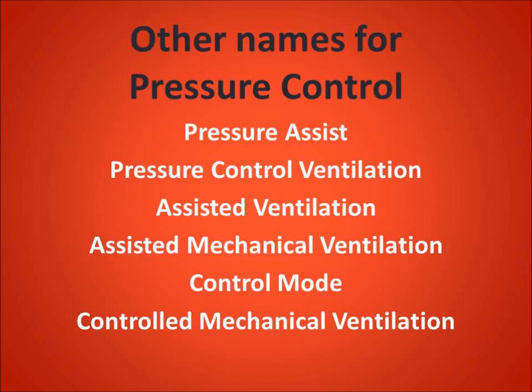Other names for pressure control are pressure assist control, pressure control ventilation, assisted ventilation, assisted mechanical ventilation, control mode, and controlled mechanical ventilation.